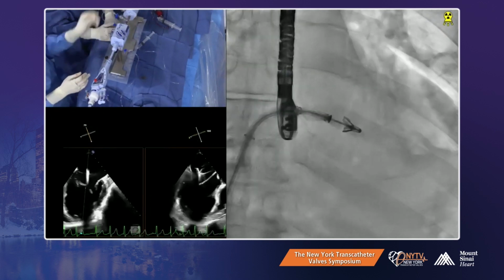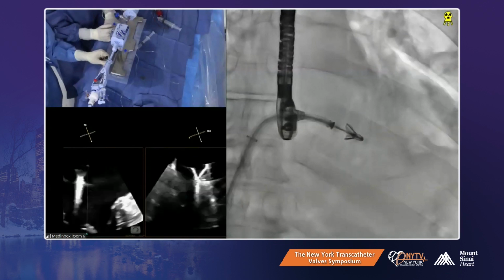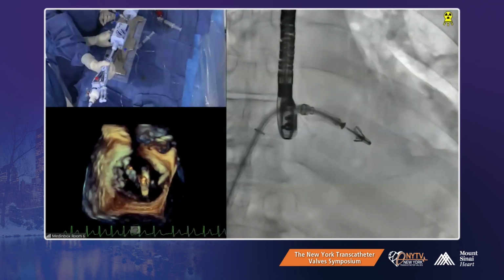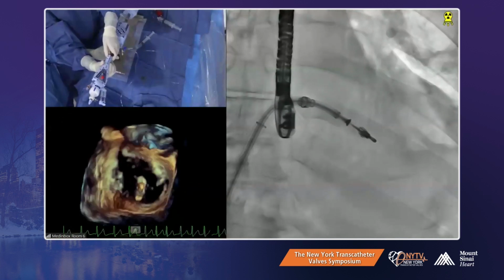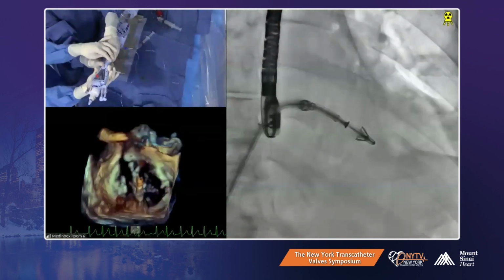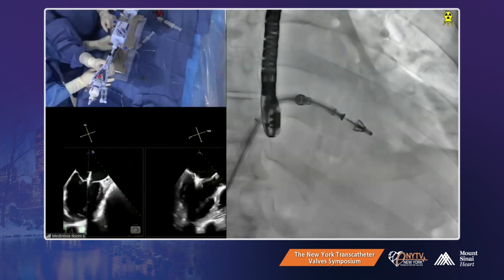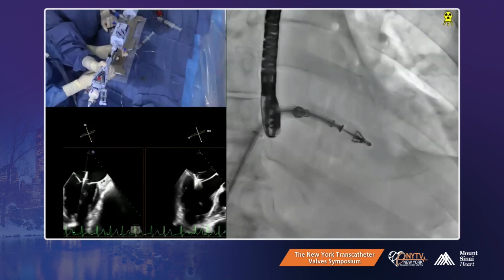How's this? The trajectory looks a little bit more favorable now, right? Do you guys agree? That's what we're thinking. It looks a little bit better. But we're not as posterior as you were before. Clock it a little, bring it more central. There you go, that's plenty. When you advance it, look at the trajectory, because it still looks like it isn't going straight. But we have a lot of plus, remember? So we have to counter that with less M. So I think it's more promising.